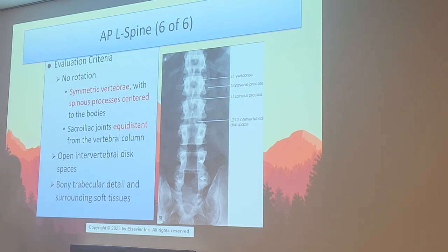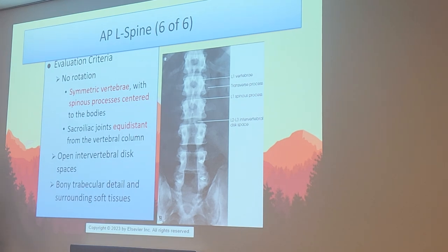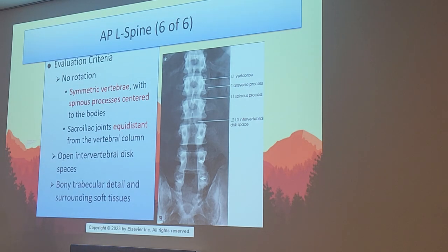You're just going to naturally shift that weight on their hips. So always do what I say, the walk around, make sure they're nice and straight. Hold still, don't move. I know it hurts, but don't move. Picture. Keep communicating to them. How else do you check that? You look for those SI joints to be what we say is equidistant. If you notice one is very open and one's very closed, it's a big indicator that they shifted their hips somewhere, like we were just talking about.